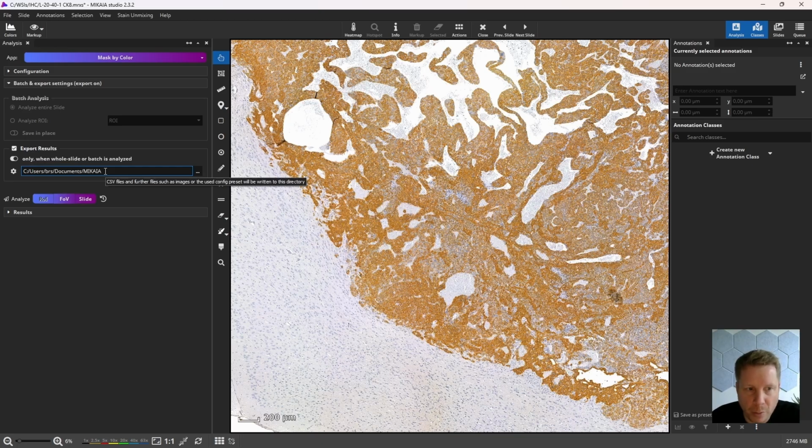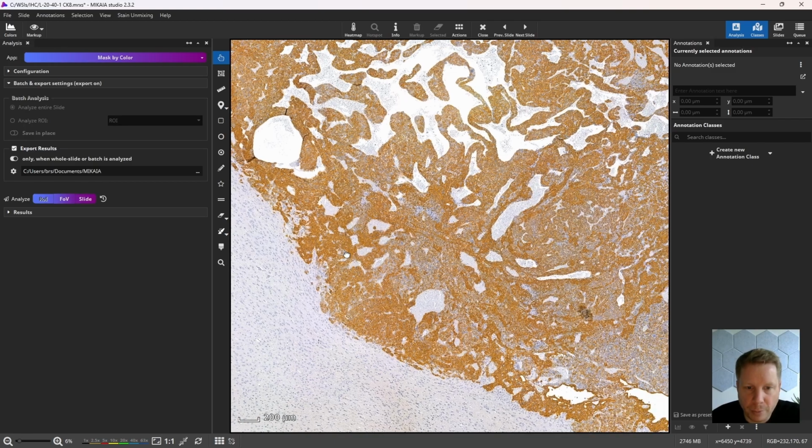It will generate a spreadsheet with all the quantitative results specific to this app, and create 2 JPEG files, one with and one without burnt-in markups, that let you quickly look at the results later. The annotation file and the parameters that were used are also saved, so that you can later still figure out what settings you used to get those particular results.